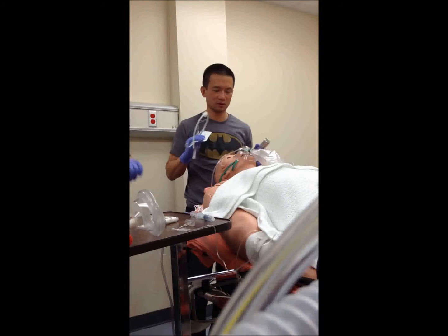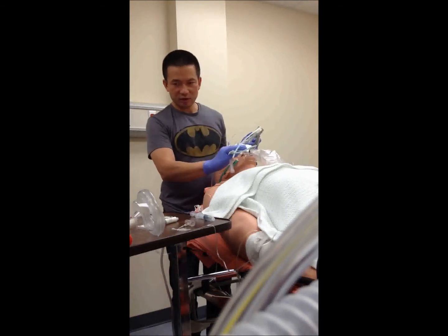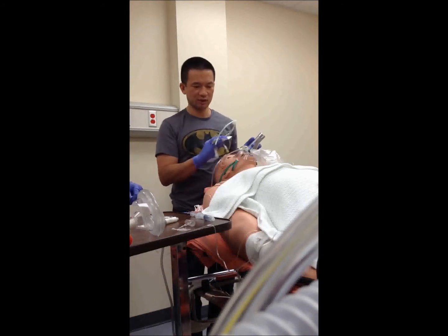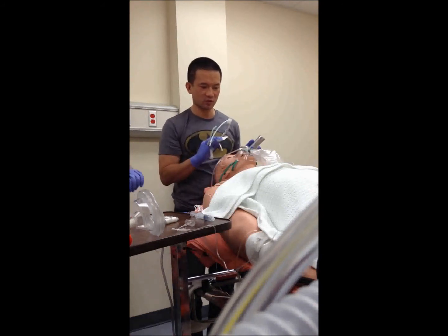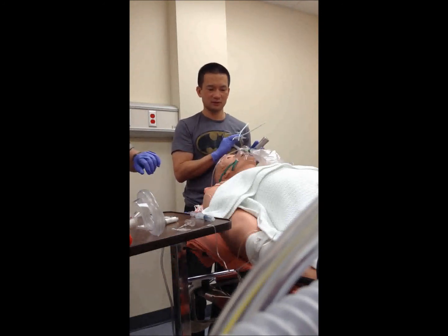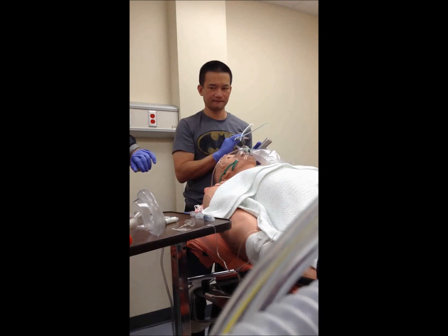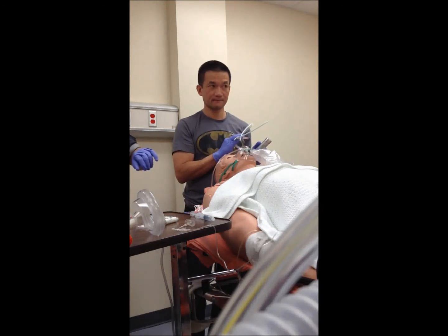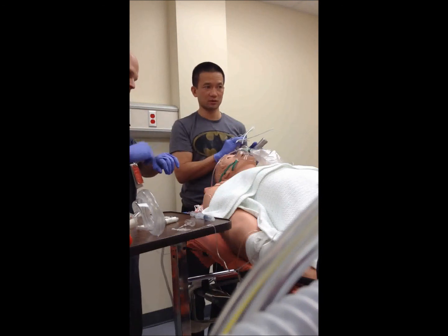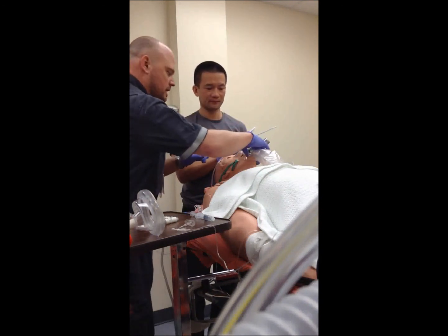We're at 20 seconds. You're going to provide thyroid cartilage manipulation while I do ELM as required. We're at 35 seconds, 40 seconds — sats are doing good, blood pressure still doing good. Thanks, Louise.